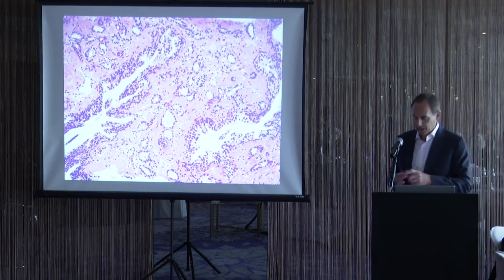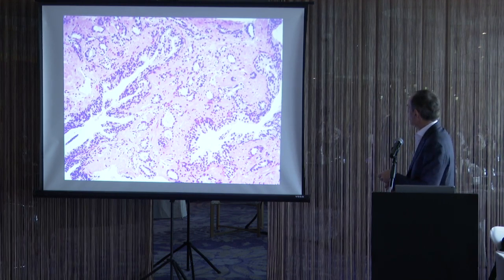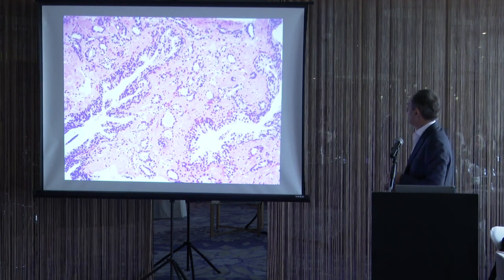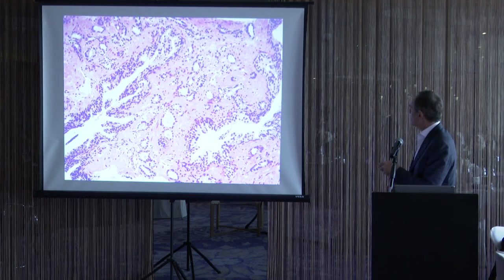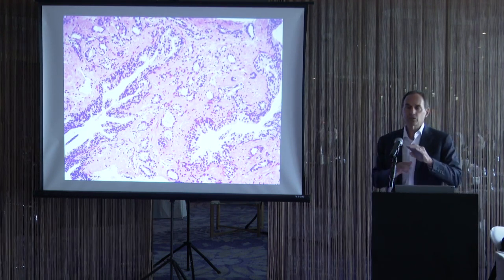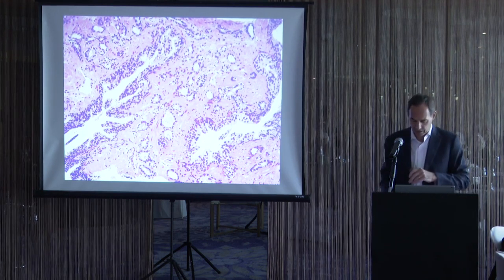Again, we want to find the glands we know are benign. Here we see these nice large glands with infolding. There's another benign gland. And we see all these small glands, but very atrophic cytoplasm. But it has still a very infiltrative growth pattern. So we see the atrophic glands here, here, and here. Atrophy never infiltrates like we see here on both sides of the benign glands.